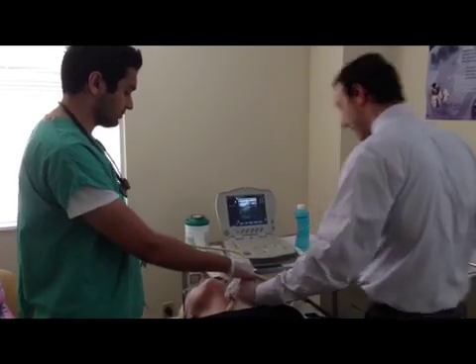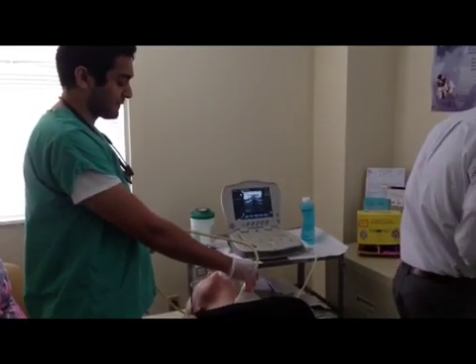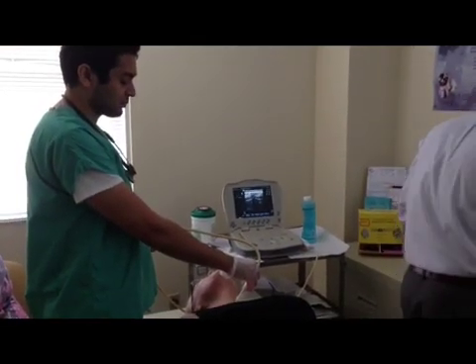Hold that. Jason, our medical assistant, is going to hold pressure in between the aspirations while we prepare the slides.